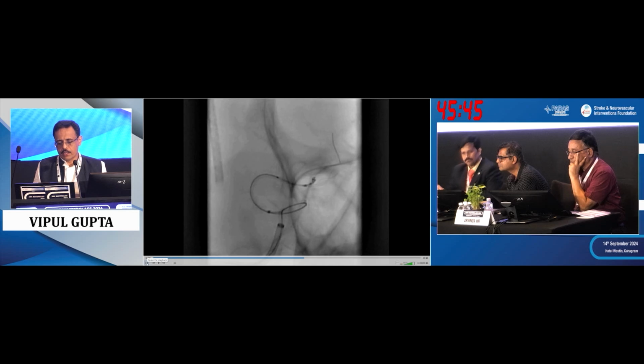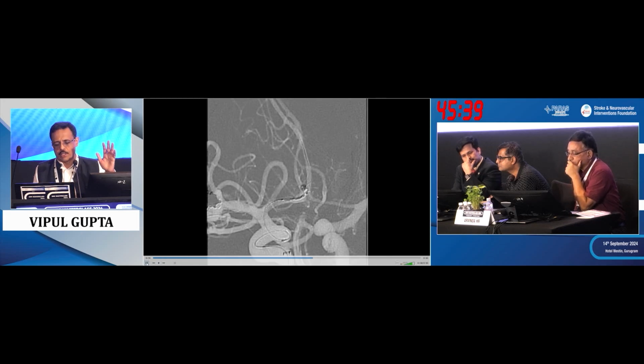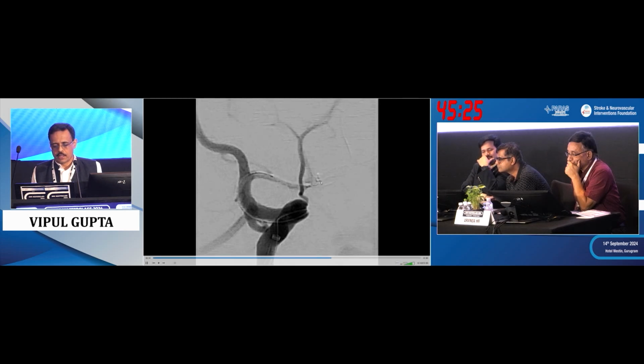We reduce the tension of the microcatheter, let it come back if it has to. It's okay. Even if a small coil tip projects, we are very comfortable. It's okay. The stent will sort of push it against the wall of the aneurysm. You can see the microcatheter is out of the aneurysm, it's just around the stent. I had difficulty putting the last part in, so I let it be there.